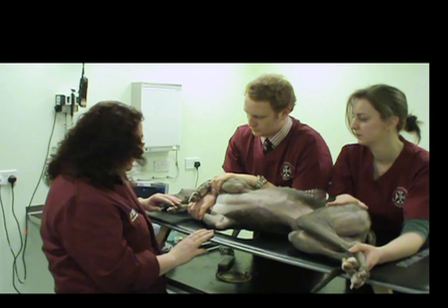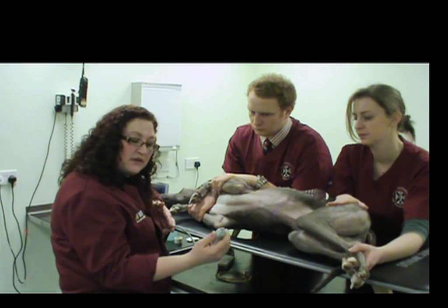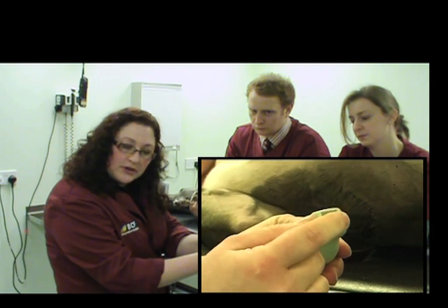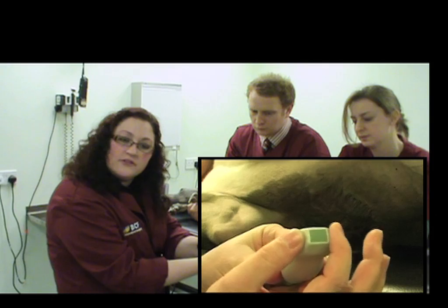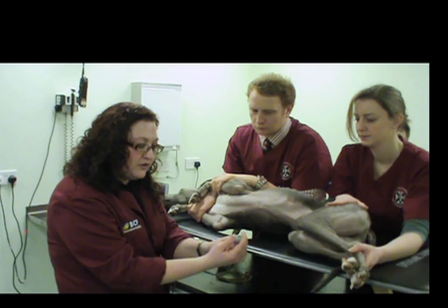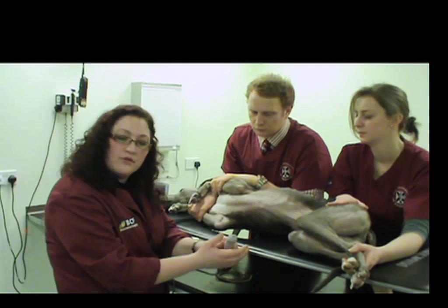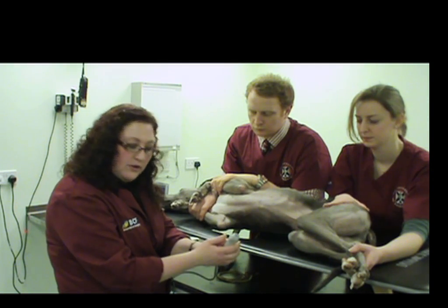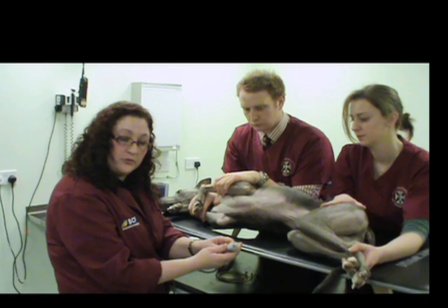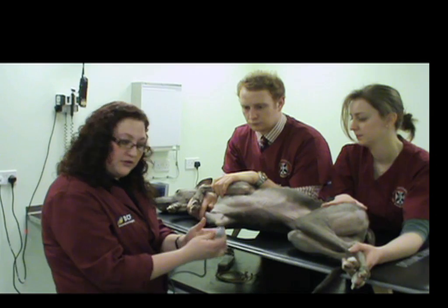The machine I'll be using today has a specialist cardiac probe called a phased array probe. Basically, this is a smaller footprint probe — meaning the actual scanning surface is smaller than you would see on some other probes. This allows you to gain very good access in the intercostal region, so you can fit between the ribs of most animals, whether it be a cat to a Great Dane. If you don't have this type of probe, other probes will hopefully be able to do the job, though it may be a little more difficult getting into the right intercostal space.